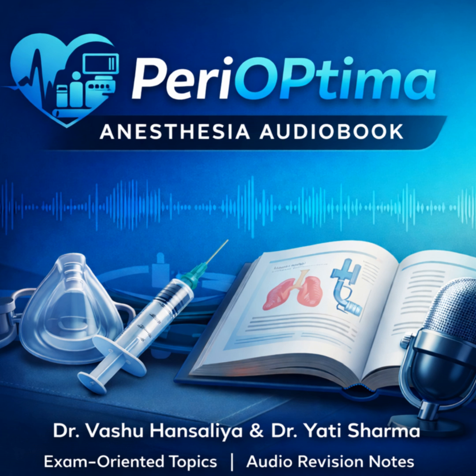For ETT, it allows for the high pressures required for very low compliance lungs. SGAD are capped, ideally under 30 centimeter H2O. What about the pharmacology requirements? SGADs require only adequate sedation, like propofol, to suppress the reflexes. No NMBDs needed, so you get rapid recovery. An ETT typically requires full muscle relaxation for safe insertion and intubating conditions, which extends recovery time.